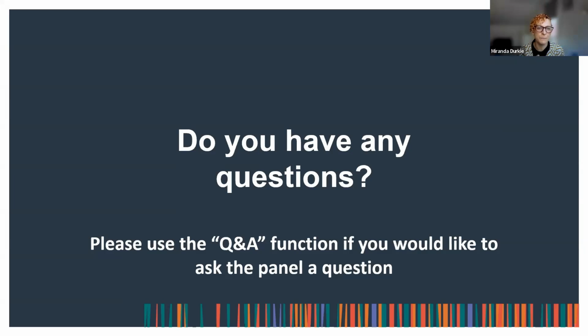No, so you'd use PM4 for a small in-frame deletion, a few amino acids, because this is a copy number variant involving one or more exons. Then you would follow the PVS1 decision tree and use it through that route. Yeah, thank you. Downgrade the strength, yeah. And then another one for the same variant: if the variant's not in gnomAD, should we not use PM2 with moderate strength as suggested by CanVIG, or was it present in the UK Biobank?